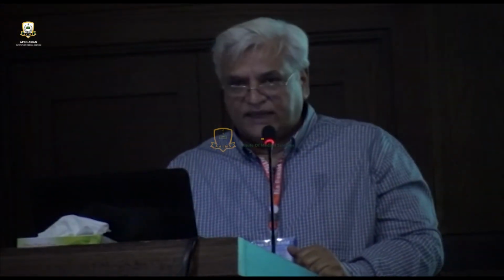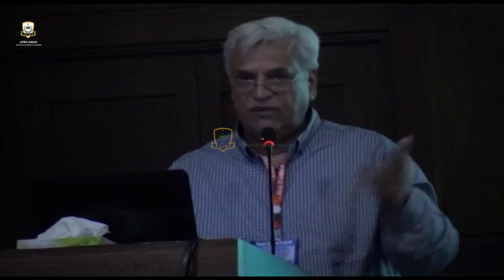So to begin with, the indication of early pregnancy is to see whether it is normal or the pregnancy is abnormal. Number two, if there is any pelvic pathology in addition to the pregnancy. And that can be either in the form of congenital anomaly, there can be a fibroid which can be a hindrance to the continuation of pregnancy.